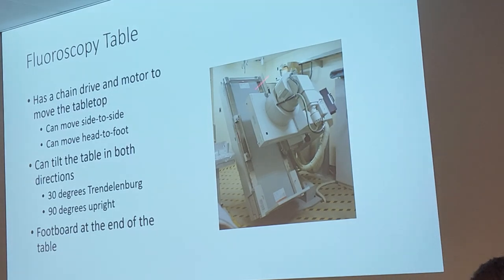So, this is fluoroscopy. I have a question. When you said x-ray in motion, I felt that when the person is moving, then you're taking the x-ray, but that's not true. It's not just taking it in different positions. It's like an x-ray movie. Like a video instead of a picture. Just think of a video.